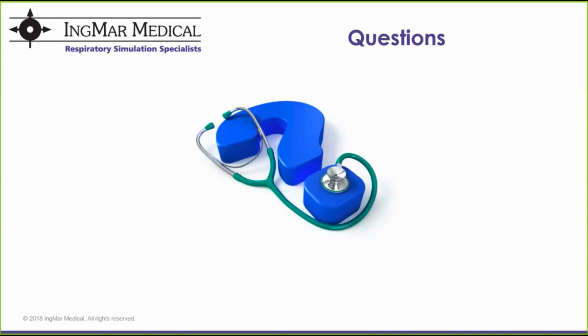So a question here from Tyler asks, how is this plugin installed on LEAP? So there is an executable file that represents our ASL 5000 plugin, and you would run that installer. It does require you to have LEAP version 6.3 or higher. But as long as you have LEAP version 6.3 or higher, after you've run the executable installer from us, then you would suddenly see our new ASL windows when you open LEAP the next time.